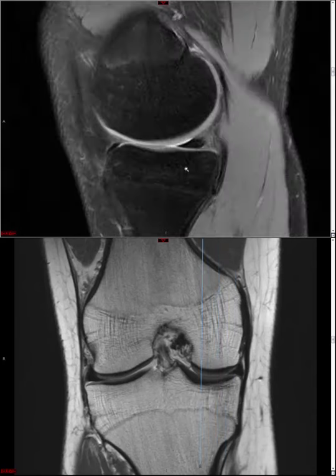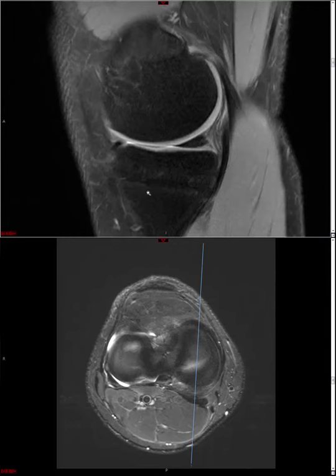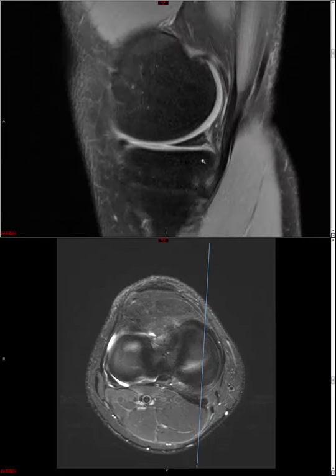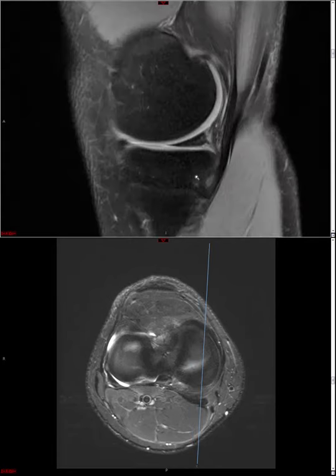All right. Generally speaking, there are two broad categories of meniscal tears. Either you have a tear that is parallel to the meniscal fibers, and that's a kind of tear where you see linear surfacing signal in one image, you go to the next image, you see that linear surfacing signal again, and you can actually follow it on multiple contiguous either sagittal or coronal images.